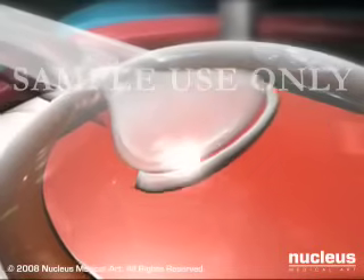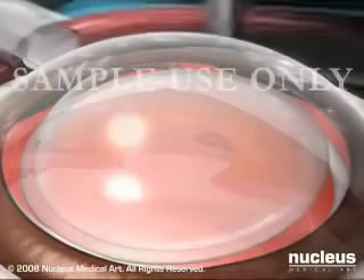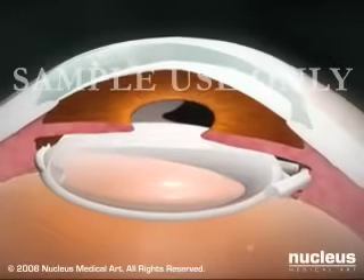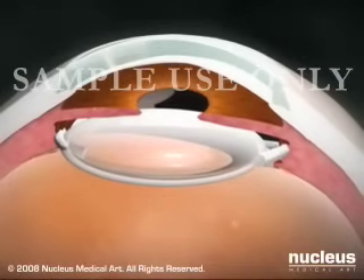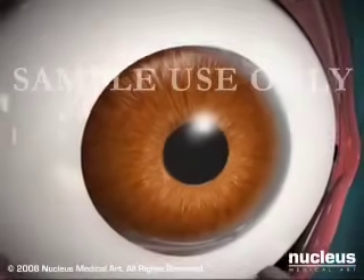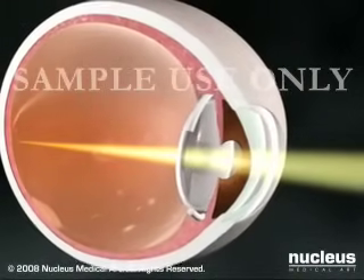Then, an artificial intraocular lens is inserted. Intraocular lenses, made of plastic, silicone, or acrylic compounds, have no moving parts and last for the remainder of a person's life. Because the incisions are so small, stitches are generally not necessary. Vision often improves notably immediately after surgery.